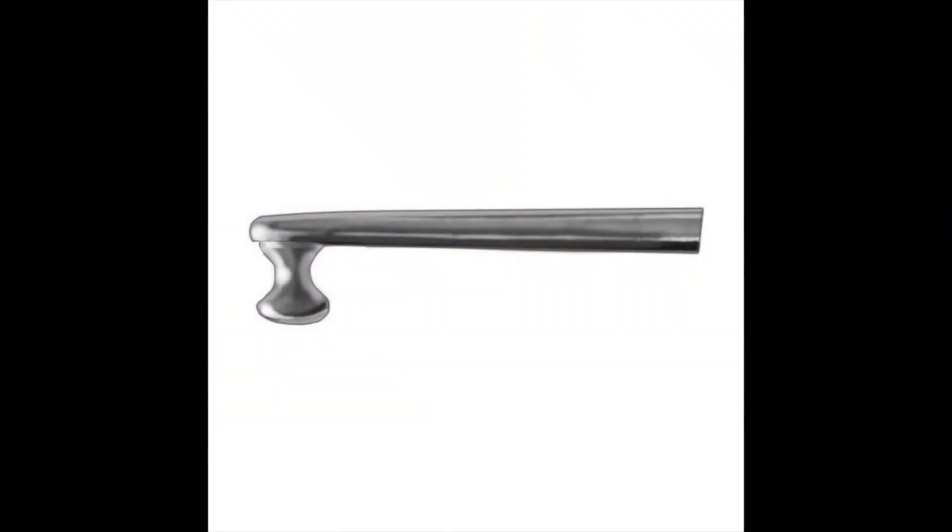I have used various hooks, including a Lester and Kuglin, but I have found the Malyugin manipulator allows for the easiest grasp of the ring.